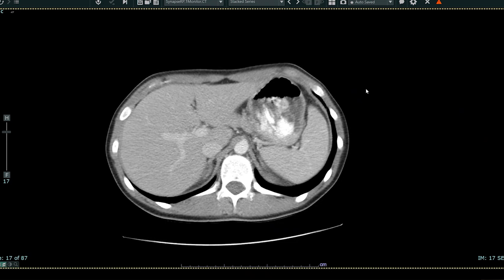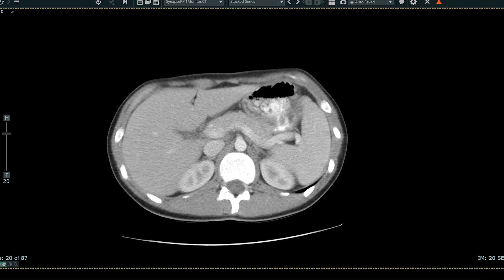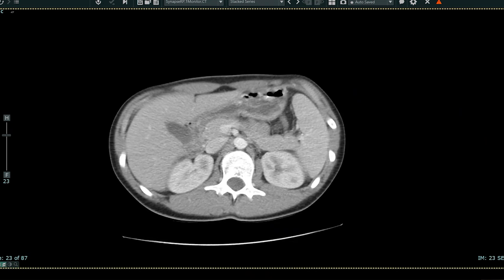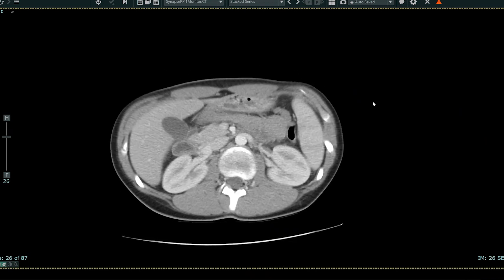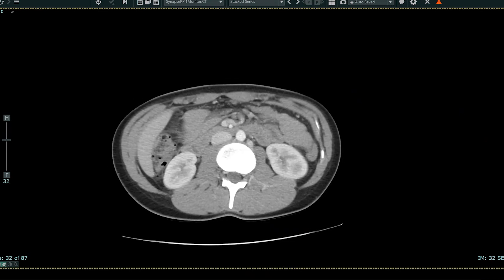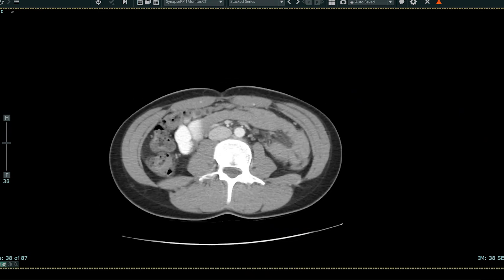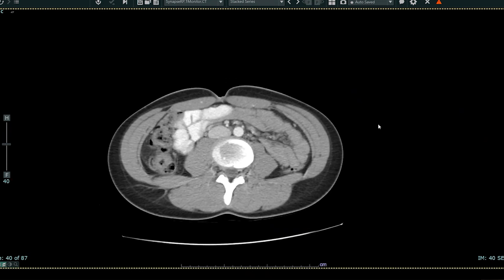As I come down more inferiorly, we see the patient's liver here. We see the patient's spleen. This structure here is the stomach. Coming down more inferiorly, we see the right kidney and the left kidney.